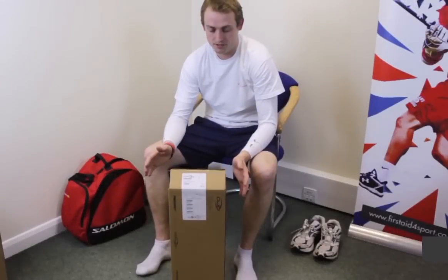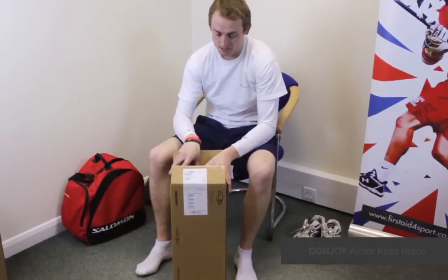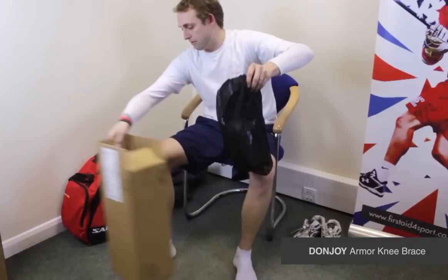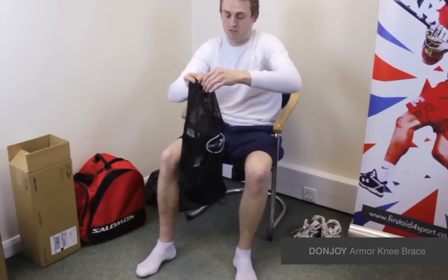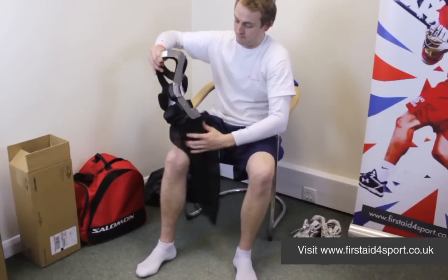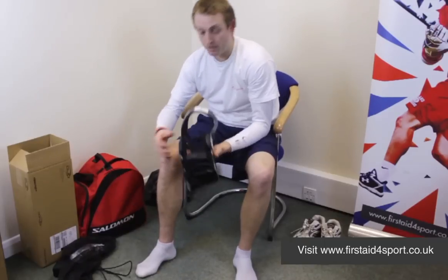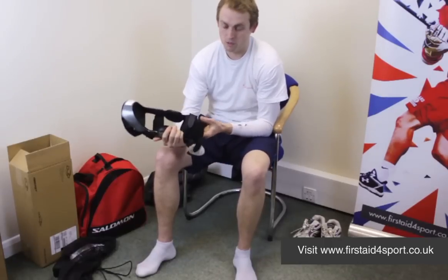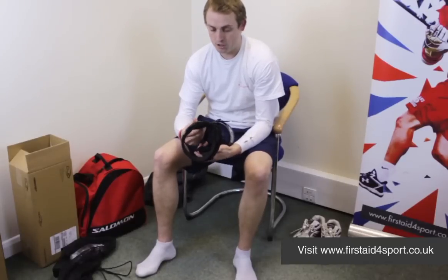I'm Michael Babison, Managing Director of First Aid for Sport, and this is the DonJoy Armour ACL. DonJoy Armour is their top-of-the-range ACL knee brace that's off the shelf. The only thing that's slightly different is the Defiance, which is their custom brace. The Armour, if it fits you, is one of the best braces that I think we've ever had the pleasure to sell, fit to people, and use myself.